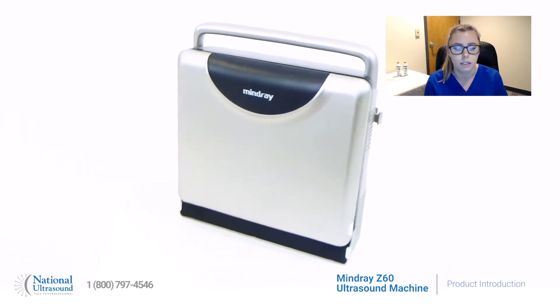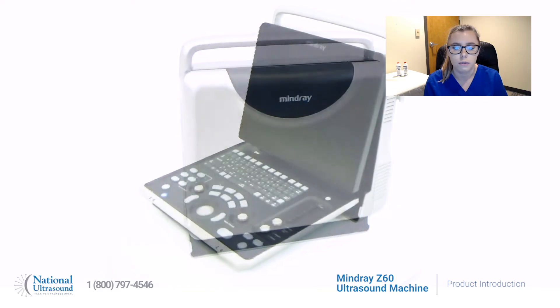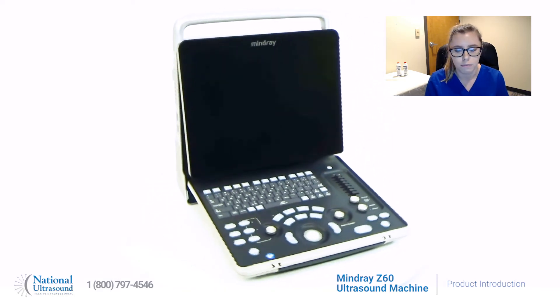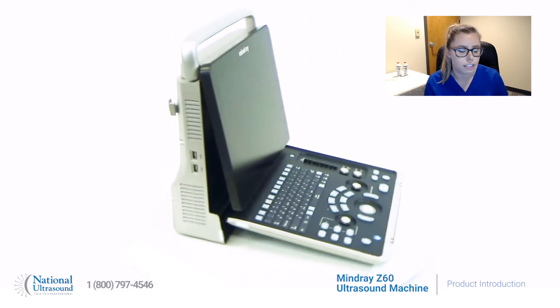Its compact design includes an anti-glare 15-inch full-screen design for easy cleaning with a 60-degree tilting feature, two transducer connectors, and a one-and-a-half-hour battery.